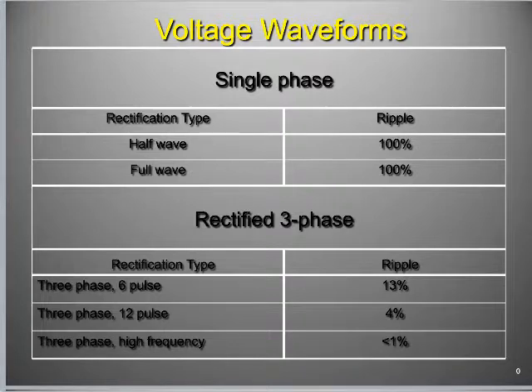All right, well, why are we wasting power? Is there a way that we can get that power going back towards Pickwick Dam and use it, right? And there is, yeah, that's what we're doing when we do rectification. We can flip the waveform over the 0 line, and then we get full wave rectification. It looks like this on page 139. It looks like the McDonald's sign.